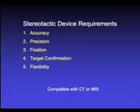Stereotactic device requirements, frame technology or frameless technology, should be accurate and precise, which refers to reproducible accuracy. Many offer fixation so that the target does not move. There should be abilities to confirm the target, and the device should be flexible so that any intracranial target can be reached and appropriately sampled. All of these devices should be compatible with computed tomography and MRI.